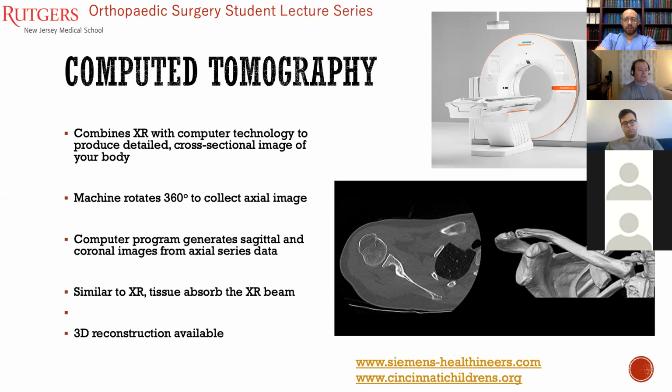Additionally, we have been using more three-dimensional imaging, essentially reconstruction of CT scans, in order to generate 3D images that you can use to help put together or evaluate a fracture pattern, something like a tibial plateau, a pelvis, a pilon, something that's a more complex fracture pattern that even with a CT scan, it's hard to appreciate the larger pieces or smaller pieces in continuity.